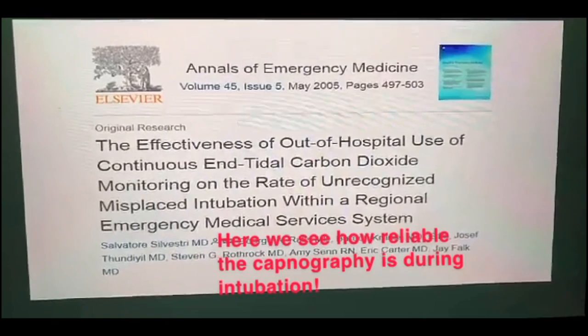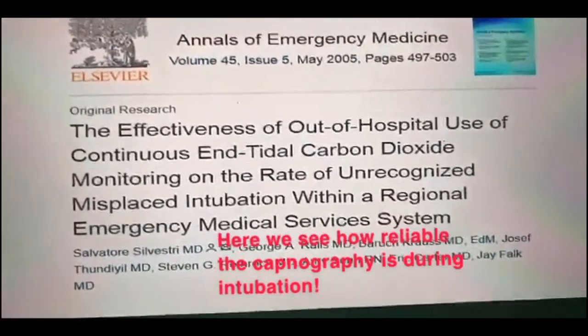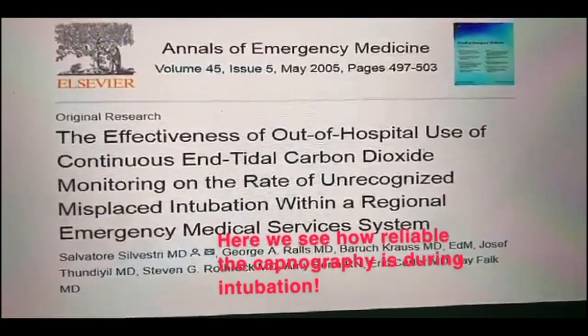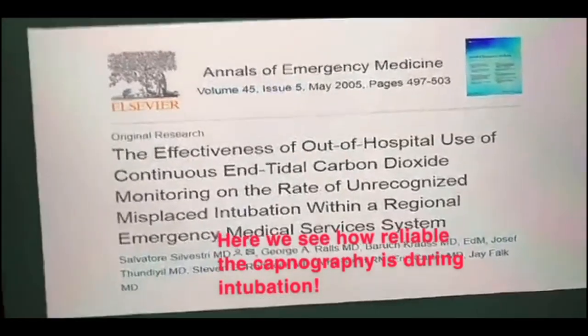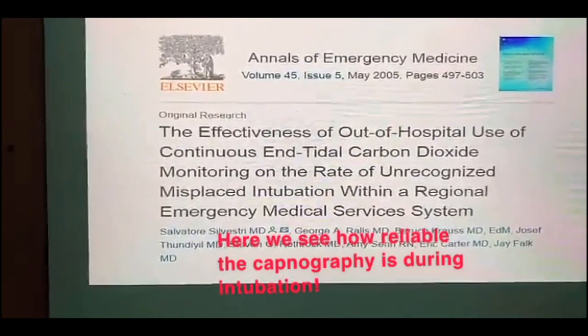Here I have a study about the effectiveness of out-of-hospital use of continuous end-tidal CO2 monitoring on the rate of unrecognized misplaced intubation within a regional emergency medical service system. So in simple words, this study talks about two groups.